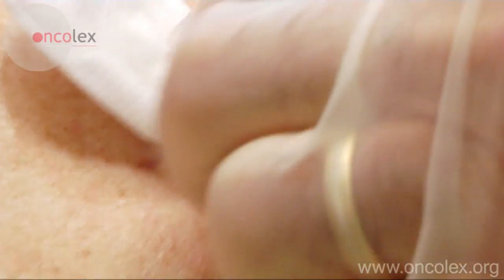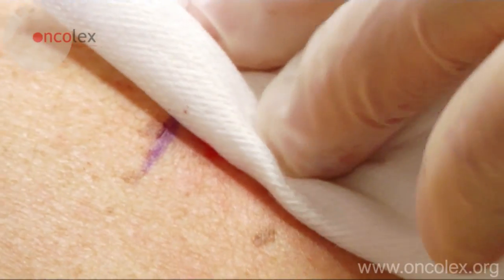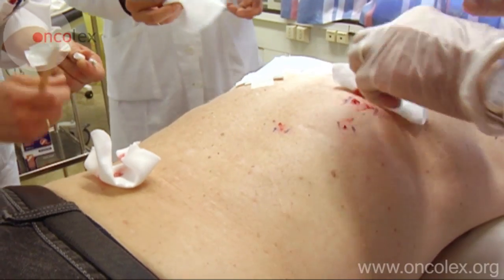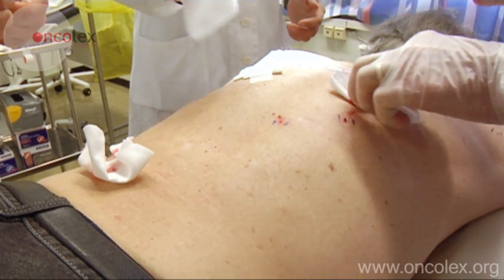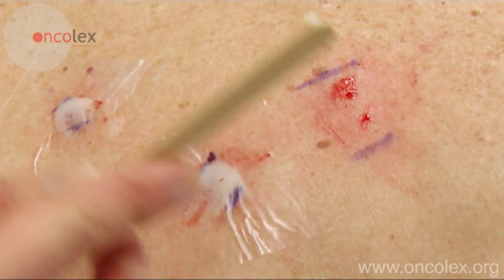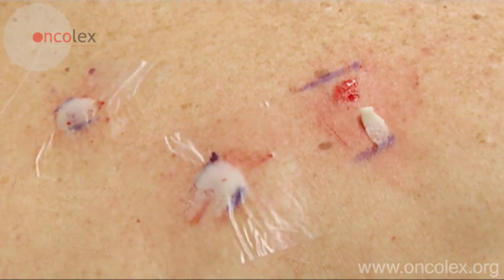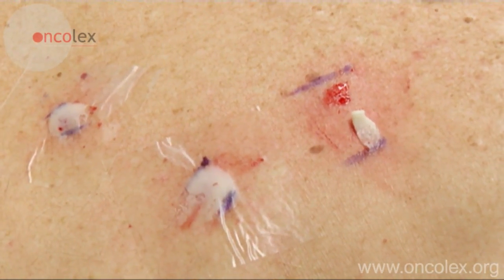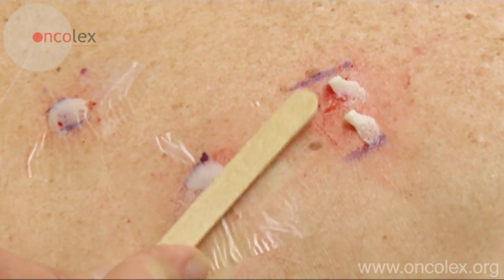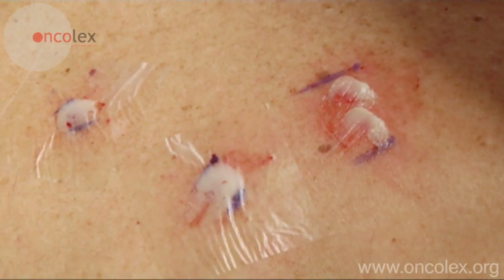The patient has multiple superficial lesions on his back. The surface of the lesions is gently scraped with a curette. The tumor tissue bleeds easily, but the surrounding healthy skin remains intact.